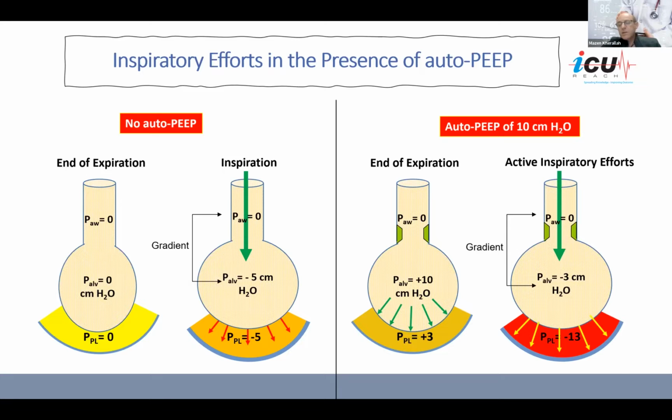And the reason being, well, theoretically, you would think, how come I'm setting the ventilator for the flow where there's no flow without decreasing the pressure? So what happens first? Is it the flow or the decrease in the pressure? No, it's the decrease in the pressure. You decrease the pressure first.